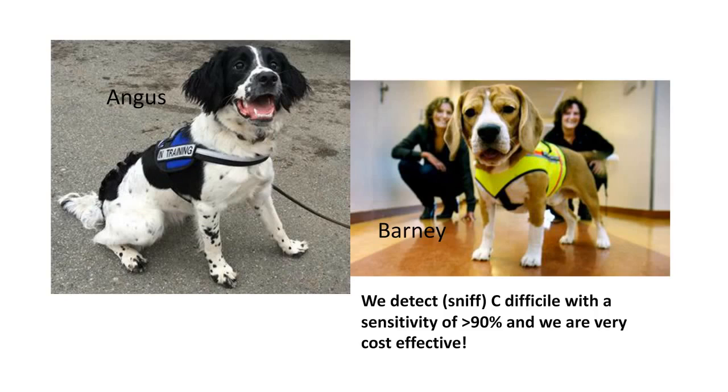Thank you, Dr. Morgan. Next question, what would cause a GDH negative and toxin AB positive on the screening test? I do not have a lot of experience with the GDH test. There is lack of specificity in the toxin A and B assay, and I think that's what you're picking up from having a GDH. The GDH screen certainly is not 100%. It's probably in the high 90s, however.